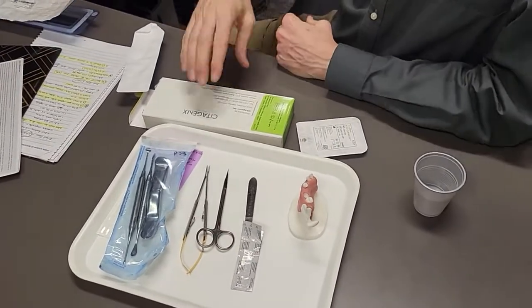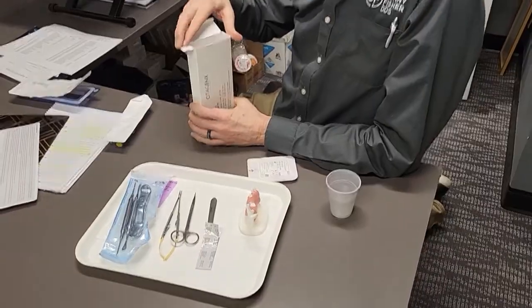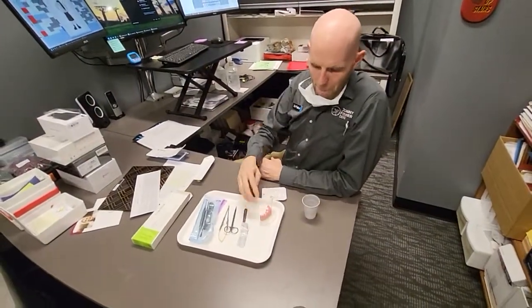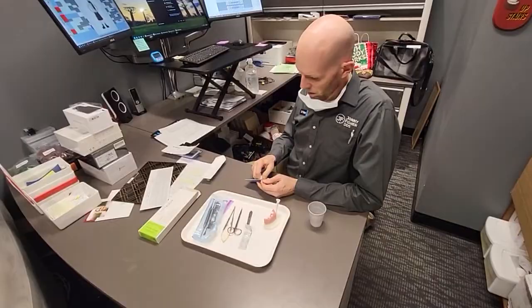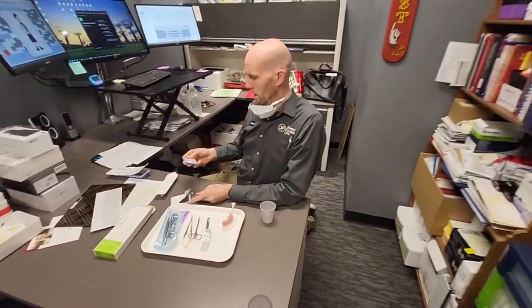All right, welcome, fine friends, to this demonstration of bone grafting and membrane placement for ridge preservation for eventual implant and/or bridge.